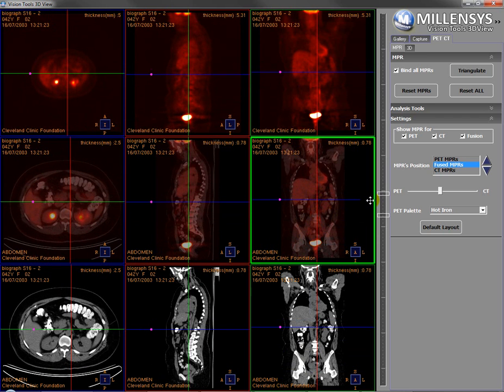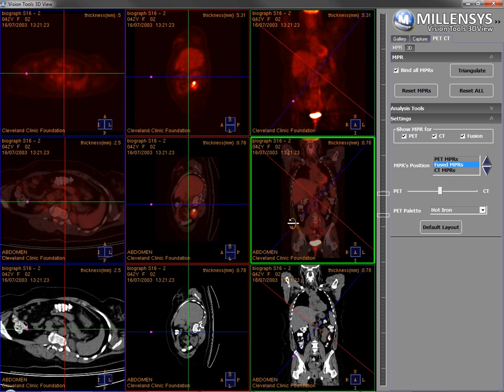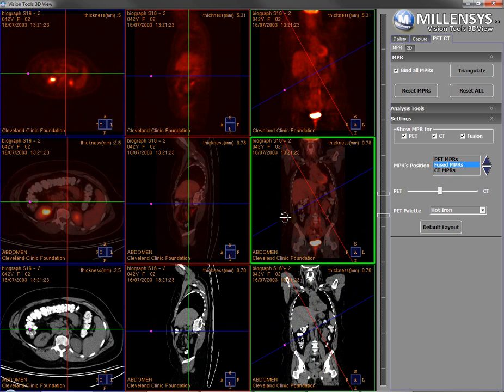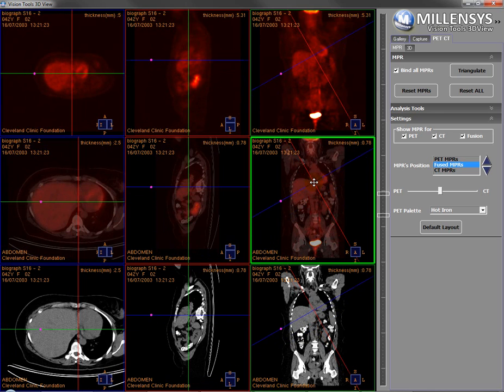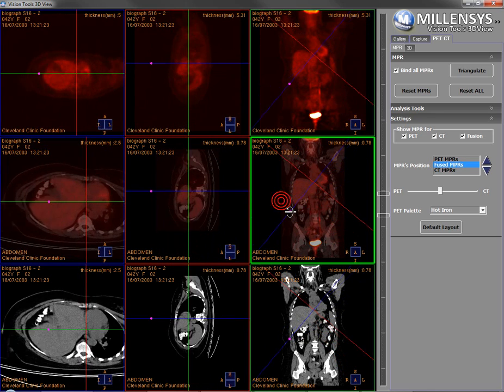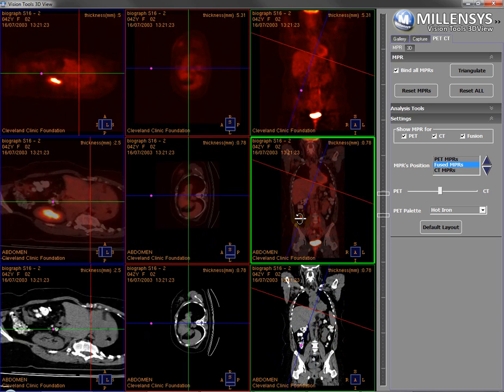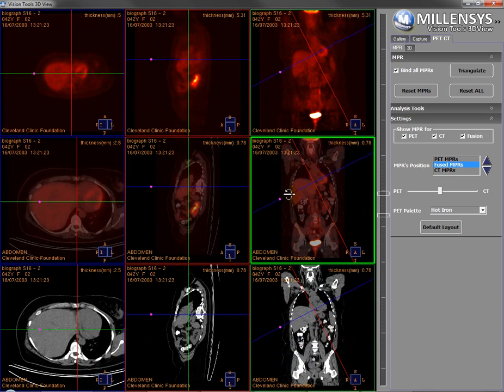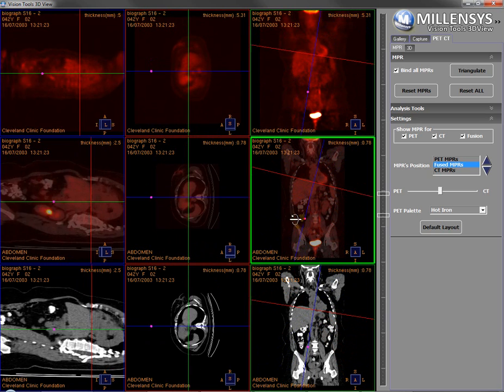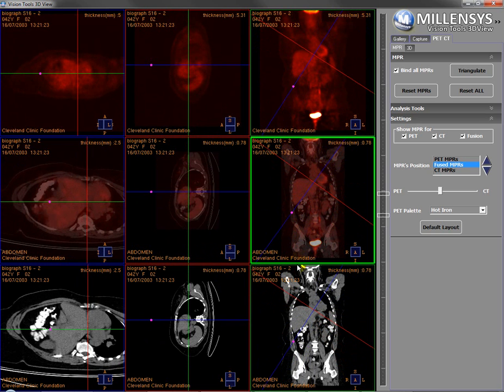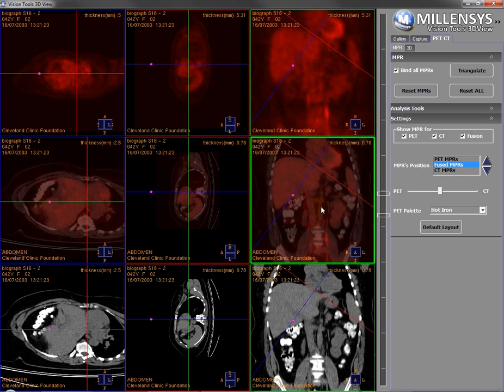These MPRs offer the oblique capability. I can rotate the MPRs from this bullet point here to any view I want — that gives great flexibility. As you can see, when I move on one view, the other views move as well. That helps us, in addition to the fusion, visualize the differences on each view.